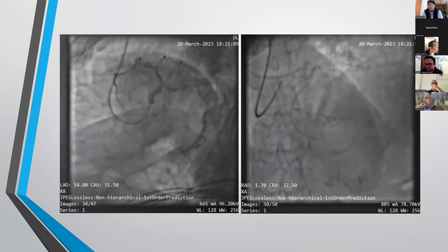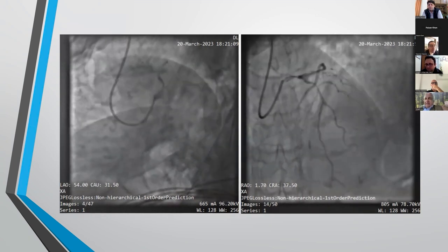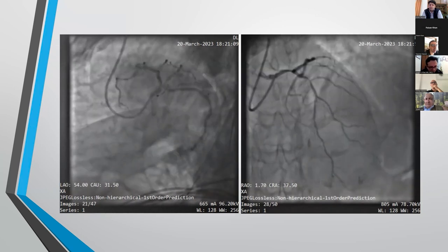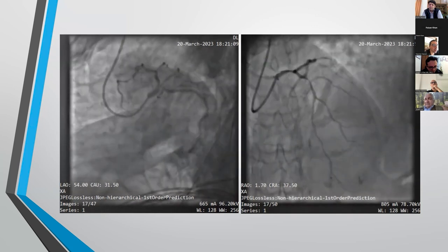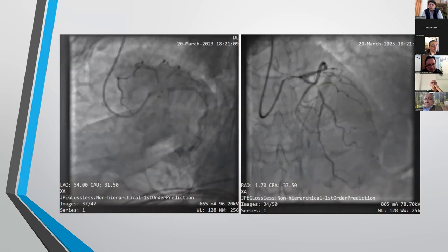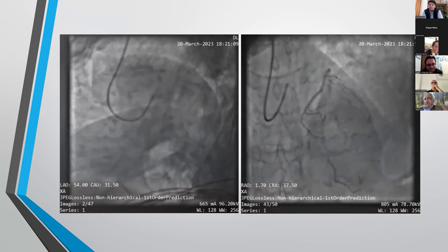But if the IVUS looks great, then it's perfectly acceptable to be happy with the result you get with the left main stem. And I'm amazed at the amount of equipment you've been using very freely in these cases, combining IVUS and FFR. That's really wonderful. I mean, you brought the first world to this country, which is very excellent.